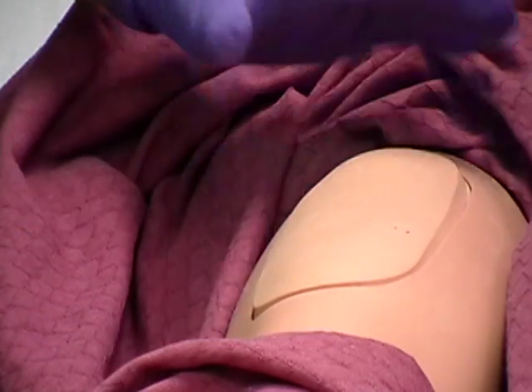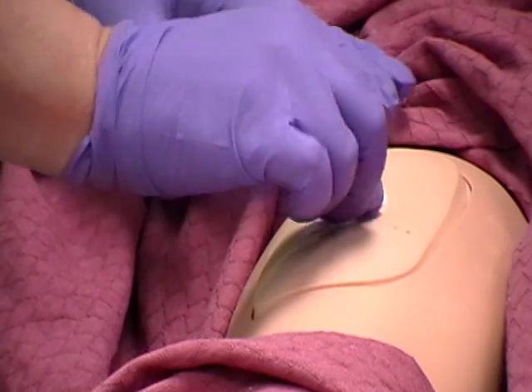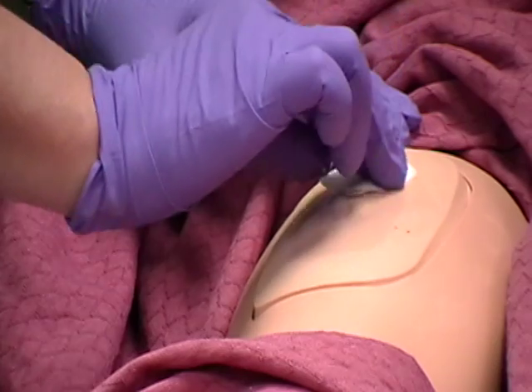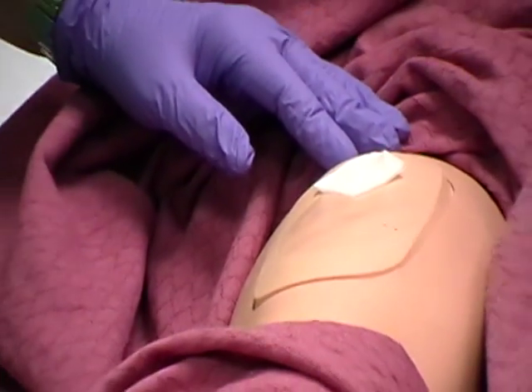Cleanse site with an antiseptic swab. Apply swab at center of the site and rotate outward in a circular motion for about 2 inches. You may leave the swab next to the cleaned area with one end pointing to the planned site of injection.